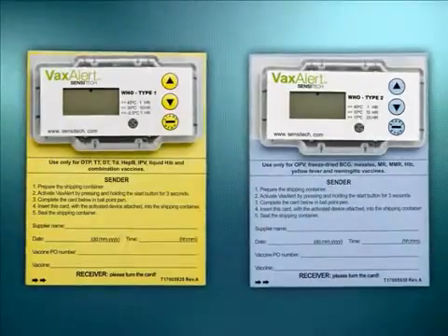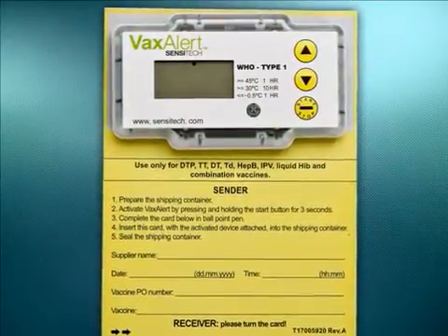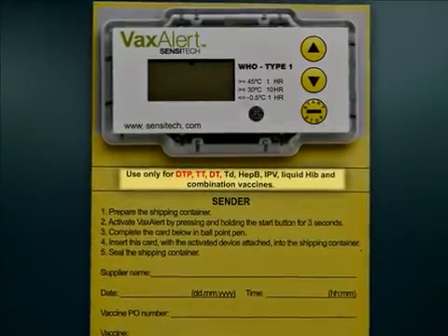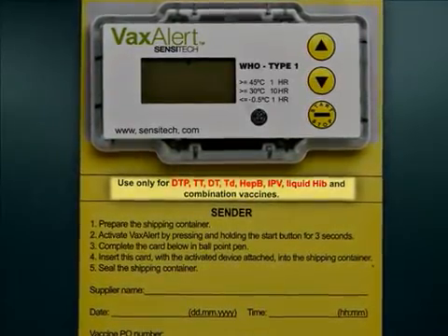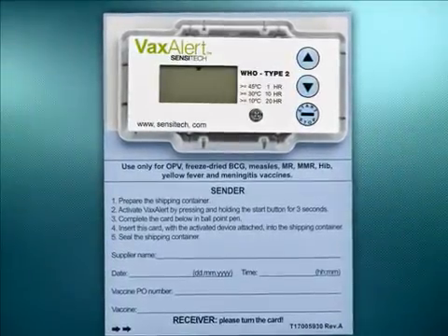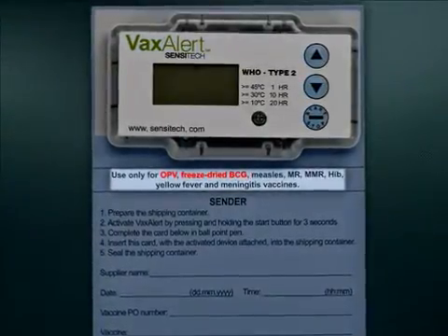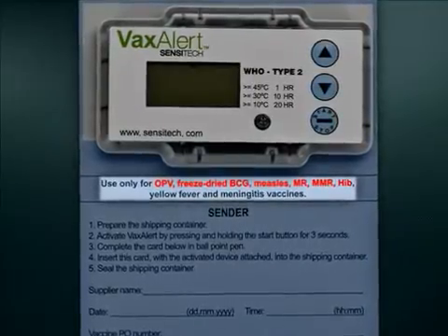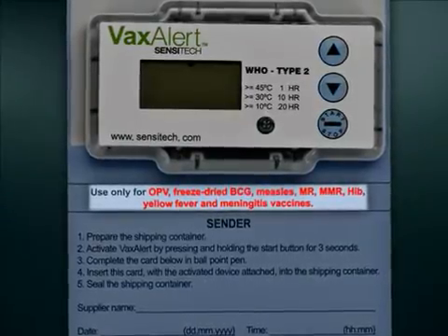There are two types of Vaxalert indicator devices. The Type 1 device is attached to a yellow backing card and is designed to accompany the DTP, TT, DT, TD, hepatitis B, IPV, liquid HIB, and combination vaccines. The Type 2 device is attached to a blue backing card and is designed to accompany the OPV and freeze-dried BCG, measles, MR, MMR, lyophilized HIB, yellow fever, and meningitis vaccines.